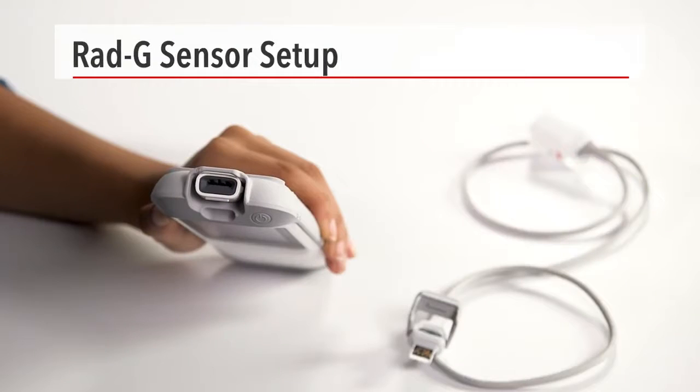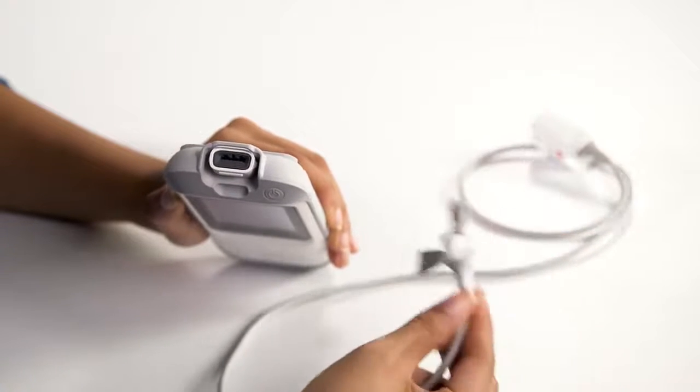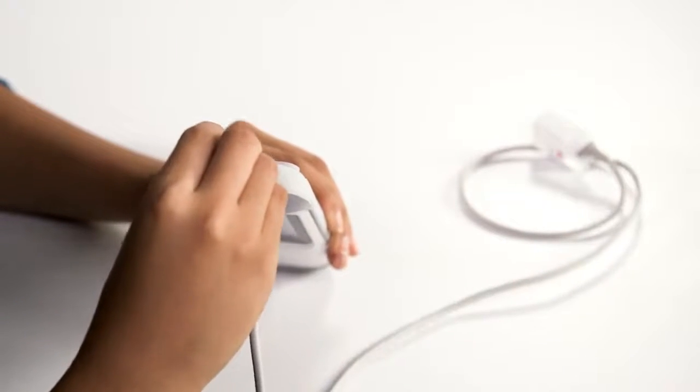To perform a measurement, connect the RadG sensor to the device by inserting the cable into the top of the device and closing the latch.